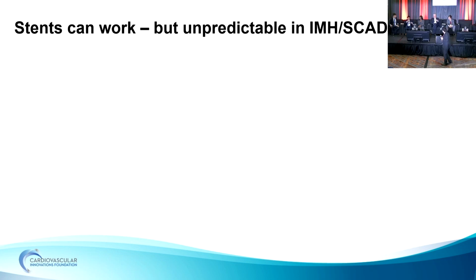Go ahead. Rajiv, quick question. Regarding the balloon angioplasty, what's your strategy? Shorter balloons, longer balloons, undersized long balloons, long inflation, what do you do? Yeah, so there'll never be a randomized trial, but I would say a 1-to-1, relatively long balloon. I wouldn't be too worried about causing damage up and downstream. You don't quite know where the point of maximal occlusion was. So in that case, it was a 3.0 by 20 balloon. Just a short inflation, 10 seconds or so. And you can always do more.